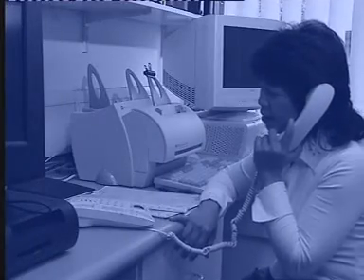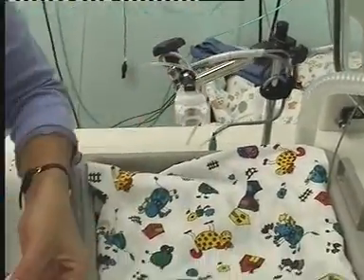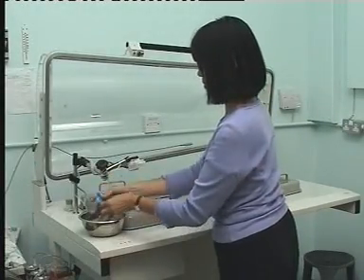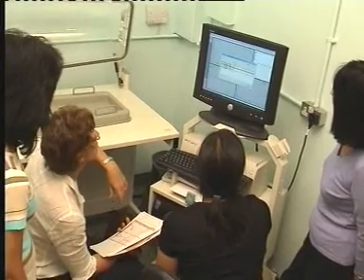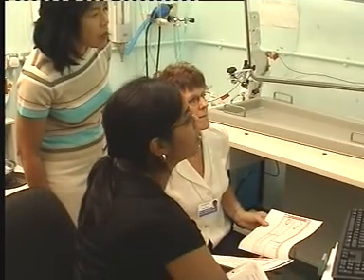A phone call should be made the next day to check everything is alright. After the family have left, all equipment should be dismantled and cleaned thoroughly according to manufacturer's guidelines and hospital policy. Prior to final analysis and preparation of any reports, all results should be checked for adherence to quality control criteria before backing up the data.